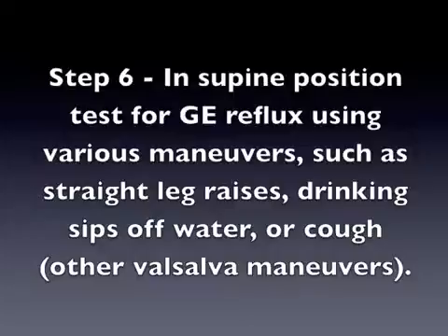Step 6. In the supine position, test for gastroesophageal reflux using various maneuvers, such as straight leg raises, drinking sips of water, or cough or other Valsalva maneuvers.